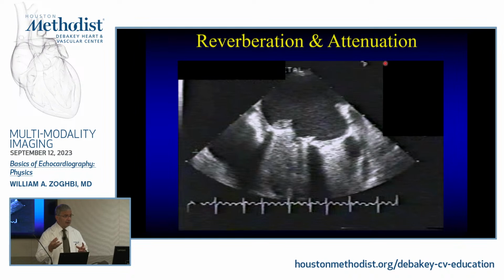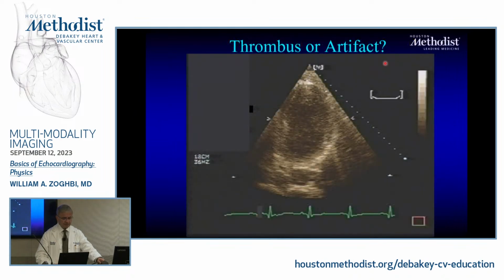Okay, one area to differentiate calcification in the annulus from caseation, you hear that name, caseation is less reflectant, so you're not going to see this shadow behind it. So that's one area to help you differentiate those, okay? So that's attenuation and mostly reflection, and you see that with calcifications or metallic issues. The other thing is you get a lot of artifact.